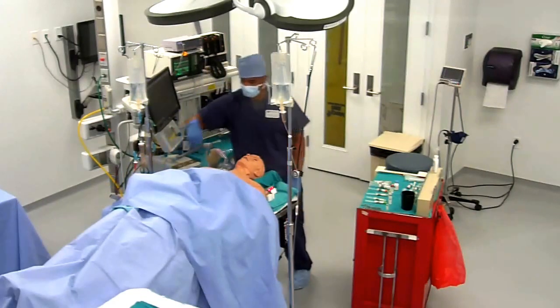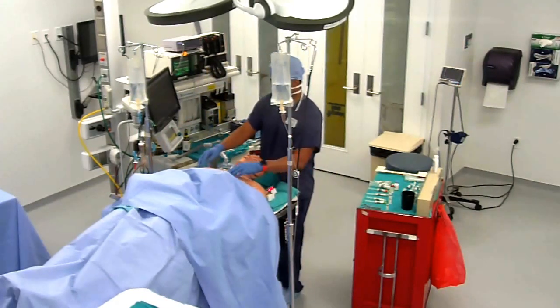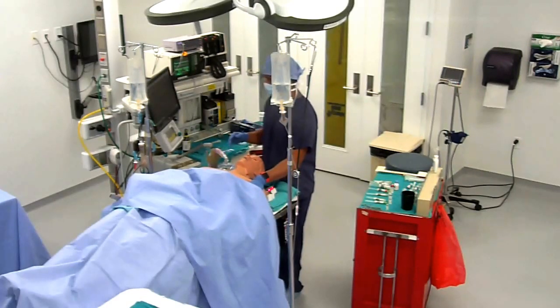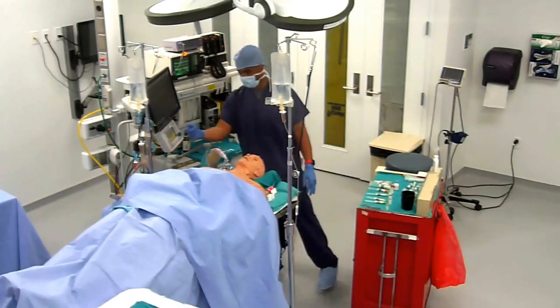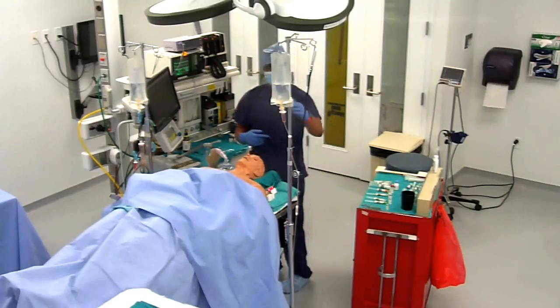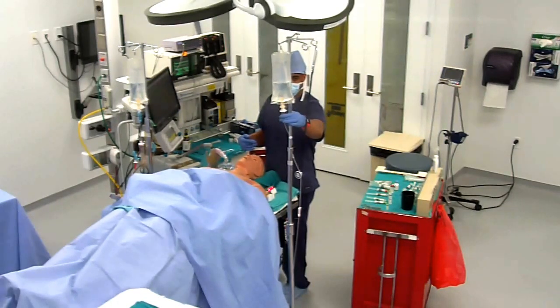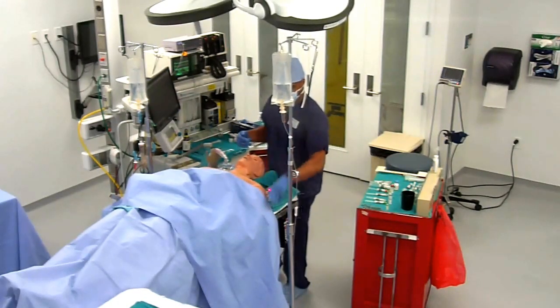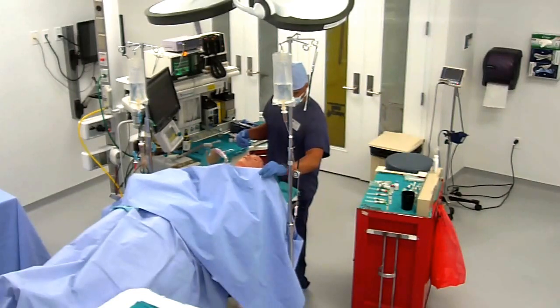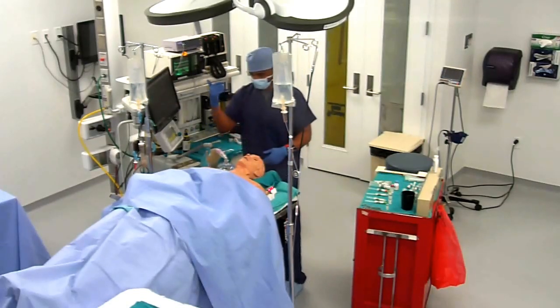measure your oxygen on room air. Also, I'm going to place these little electrodes on you, and I'm going to put this blood pressure cuff on you. So I got blood pressure, I got an oxygen reading on room air. And then also, I'm going to make sure her IV is patent, not expired, and working and infusing. And it's clear, no wires are tangled up on my IV. And of course, blood pressure cuff on the opposite side, not including the IV or the pulse oximetry.